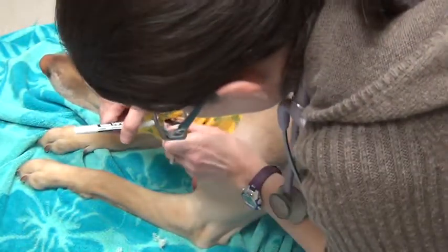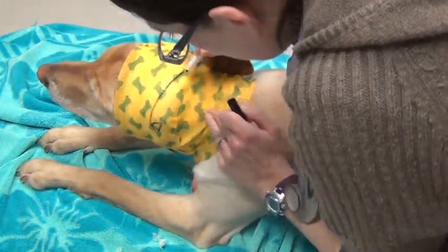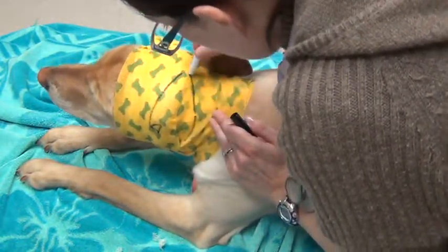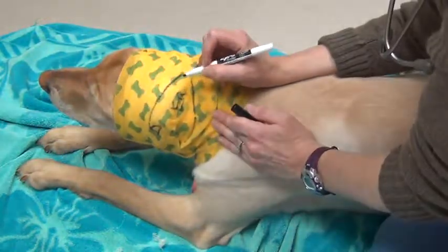Very important step here. We want to draw where our ear is on our bandage. We don't want anyone to come in and cut the ear. So we're going to draw a cute little picture that says ear on here.